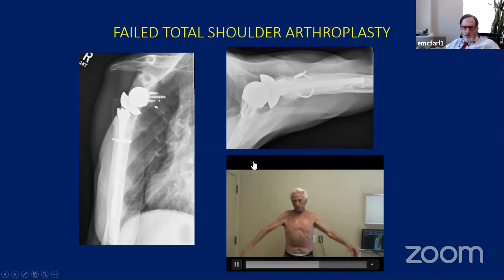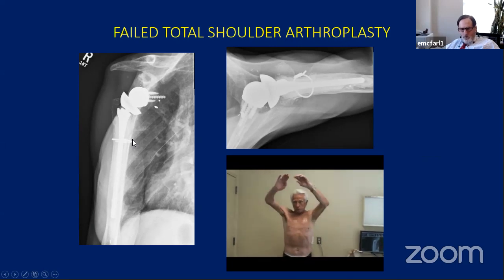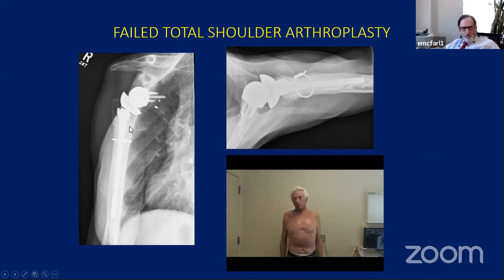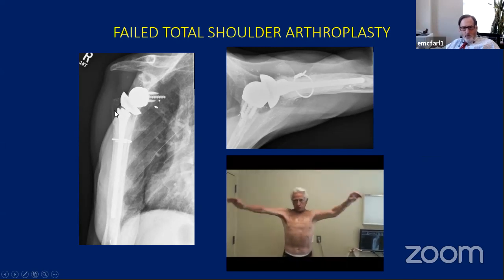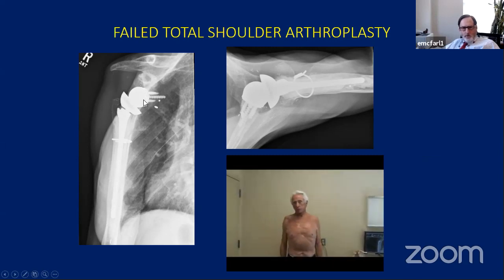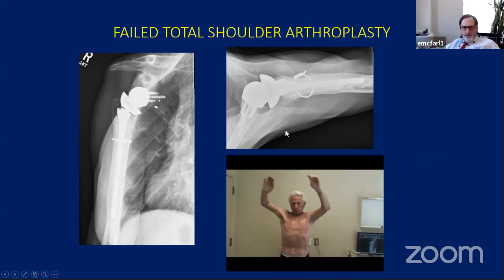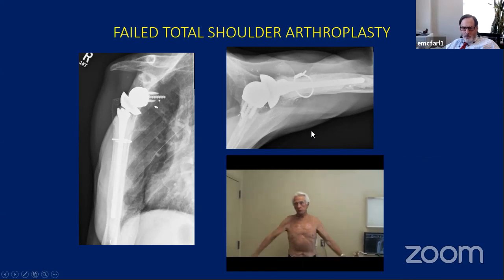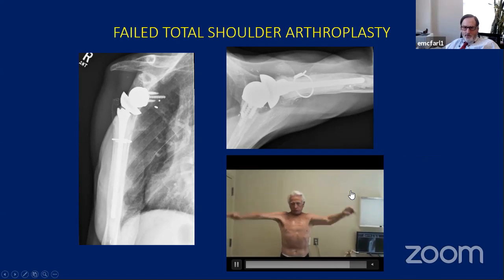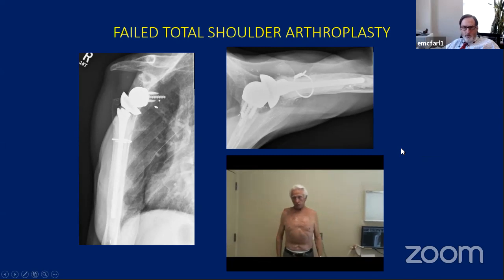It's almost unbelievable. We did manage to crack his humerus here. Actually, we had to split it to get his component out. But at least his tuberosity is involved. And so some people, particularly if you bring the base plate down low, they get this sort of sulcus out here. It's a little unsightly, but it doesn't really affect their function very much in my estimation. So this is a guy who, in the past, we would have just told him too bad, live with it. And now he's really pretty happy with the result.